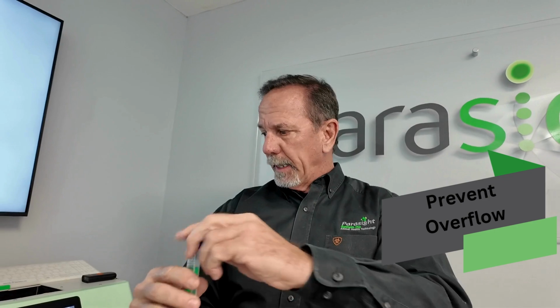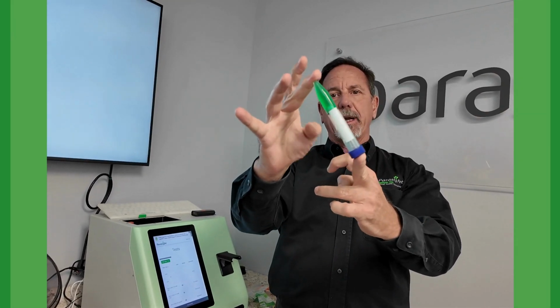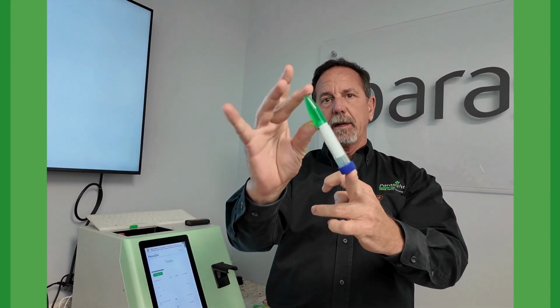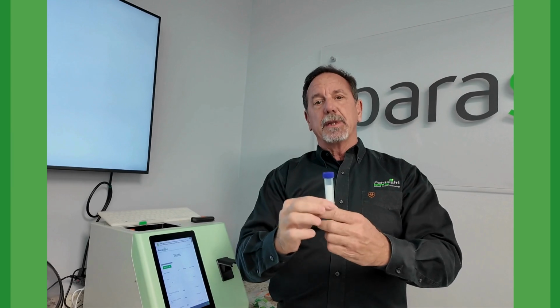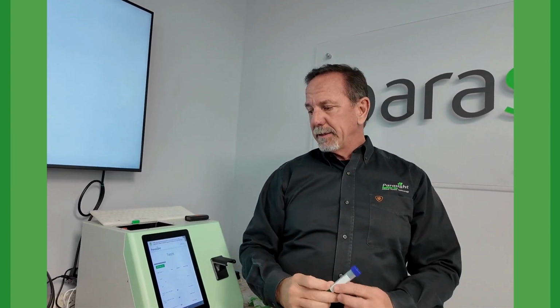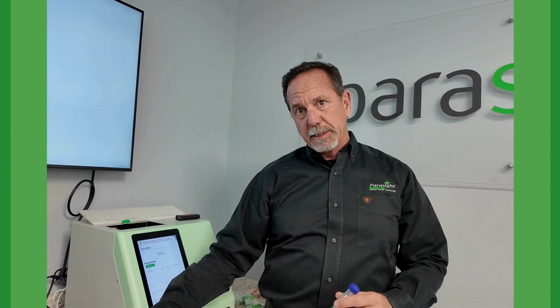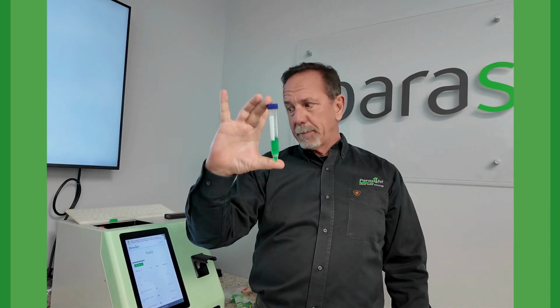You'll see that even if I pour this out, that does not pour in, so we do not pour in all the liquid. What we find out, and I've done this myself, is you forget to put the egg separator in and you put all the liquid back in there, and that defeats the reason that we wanted to centrifuge and that we also wanted to be able to have that egg separator in there.